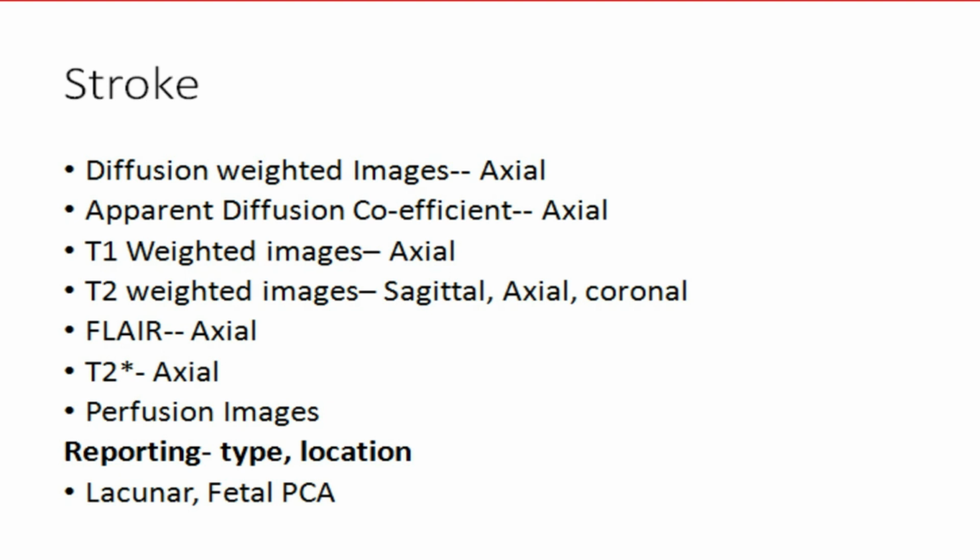This is a common mistake I have seen in everyday practice, because most of the private MRI in Multan are 0.5, 0.7 Tesla. They don't do DWI images. And the technicians don't even know how to do it. And even if they do it, they don't do the ADC map. So how are you going to say it's an acute stroke? It's not something else. Okay.